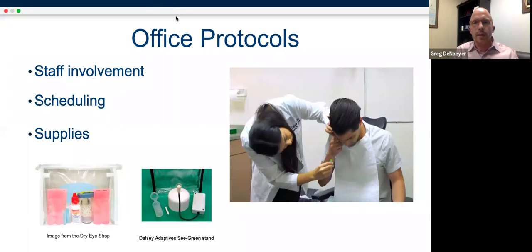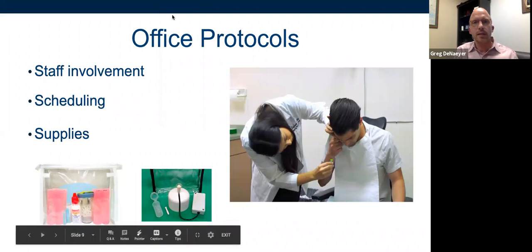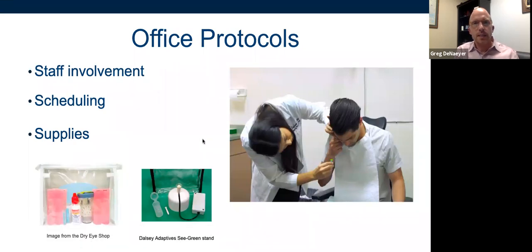From a clinical standpoint, I don't know if it's just how I started, but I have my hands in everything clinically. We fit patients using corneal scleral topography. I do that measurement myself because essentially that's taking care of the fitting process, so I want that to be as perfect as it can. And I put the lens on for over refraction. When we dispense the lens, I dispense it, and I also do my own application and removal training because to me, that's such an important step.